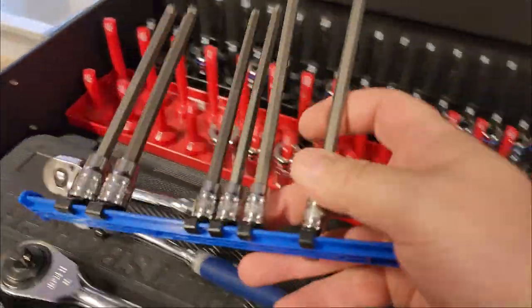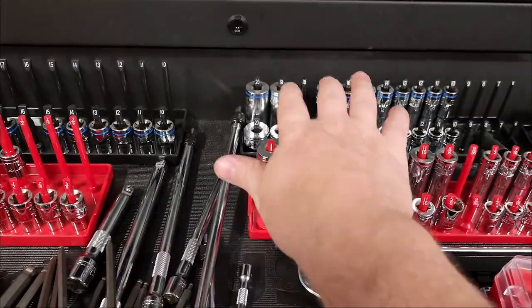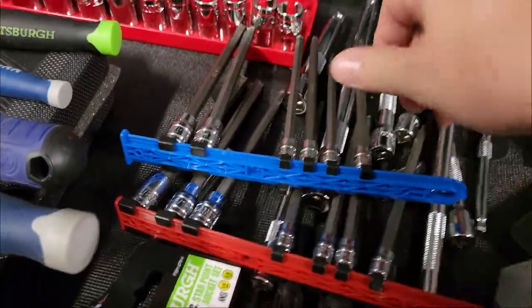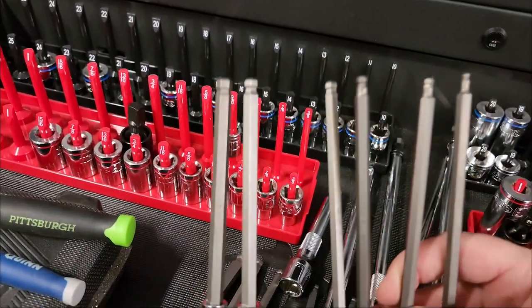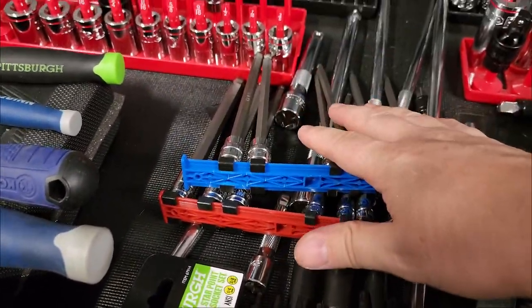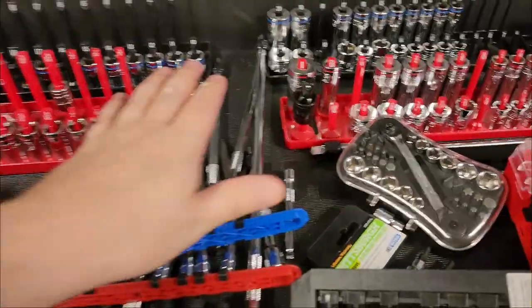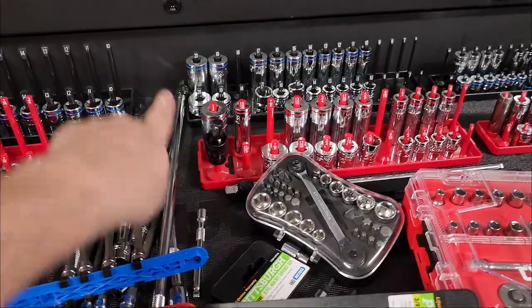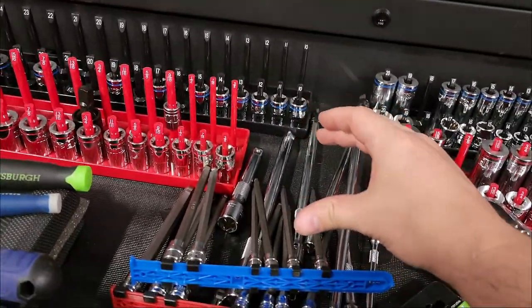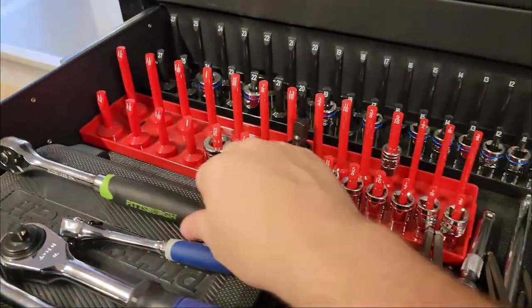There are also bit drive sockets — these are quarter inch drive sockets with hex bits attached, very useful for delivering a lot of torque. Keep in mind that as you use longer extensions, the torque delivered from your ratchet or impact driver is reduced the further the source gets from the fastener. So the shortest extension possible is usually best.